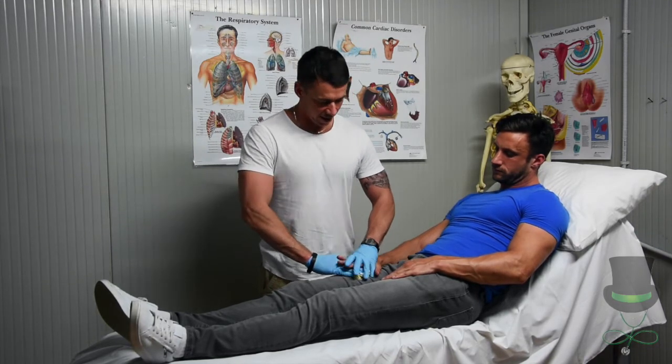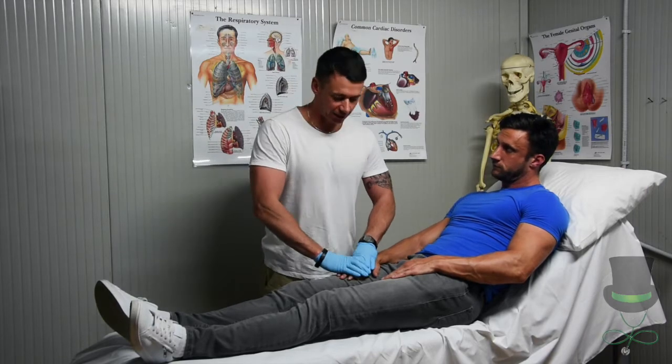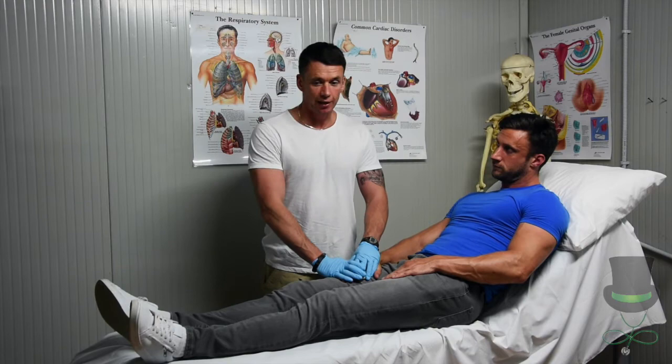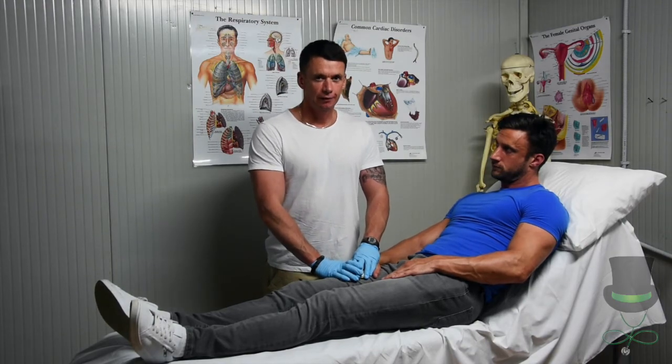When the gauze is in place, the patient will hold it in if he's conscious. Keep the pressure on and apply your Israeli or emergency field dressing.